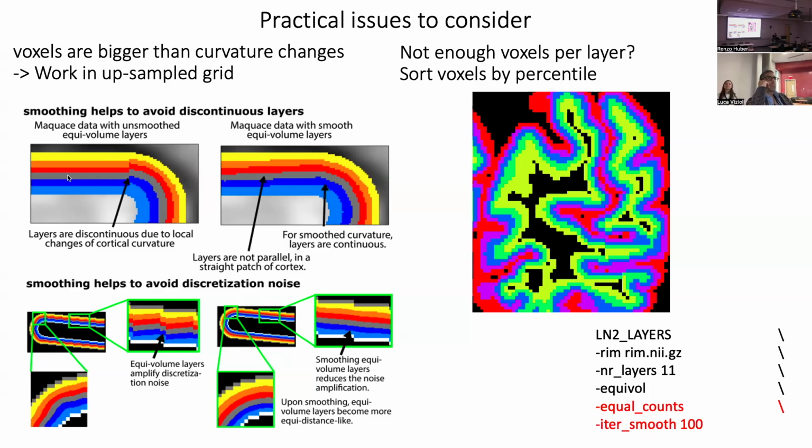This is an example from Josine, a monkey cortex that has an almost perfectly straight cortex, and then it basically has a U-turn and goes back. Now, if you think of equivolume, you need to preserve the volume. However, it's not really telling us how big a column is. Like, how big is that volume? And if we do this on a column by column basis, the equivolume principle, then we have these step functions, right? Because now suddenly the inner cortical layer needs to be thicker. That's not physiological, and it also tells us how the equivolume approach is not the ultimate answer, right?